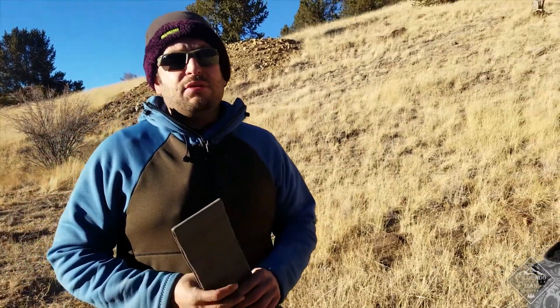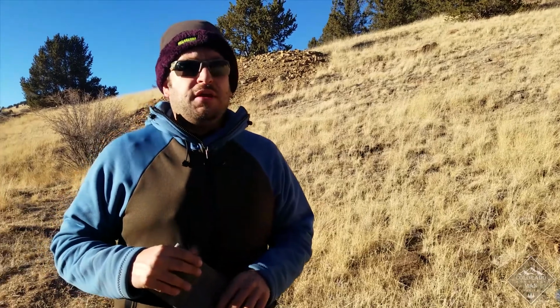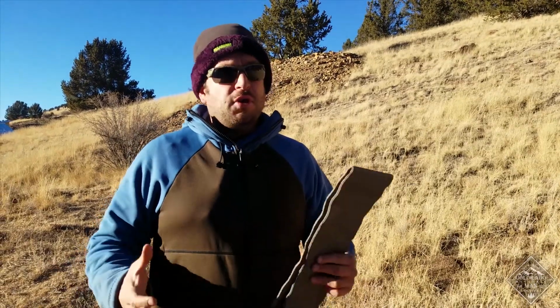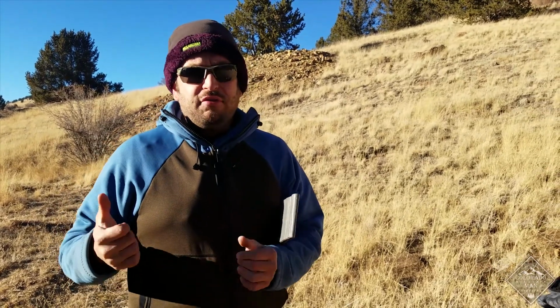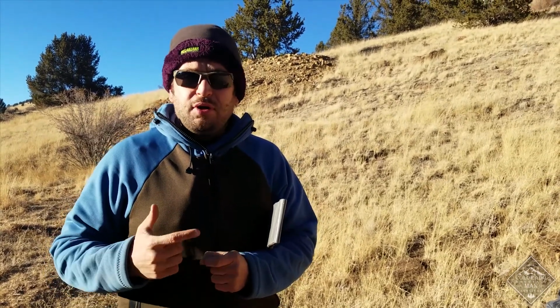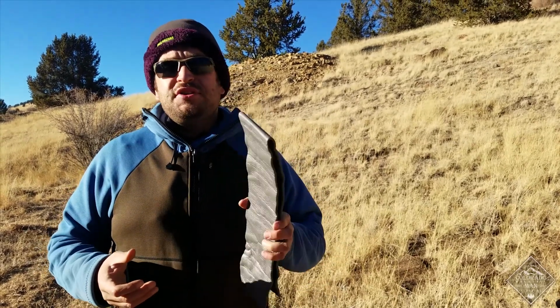All right, guys, so we're talking about manual inline stabilization of the cervical spine today. The gold standard would be that you'd approach with a few other people who are all trained providers, and one person's only job would be immobilizing the injured person's head and neck, protecting their C-spine. But in the backcountry, often you don't have the resources or trained people or whatever you need. So in this one, I'm going to show you how to quickly put a C-collar on somebody so you can do the rest of your assessment.